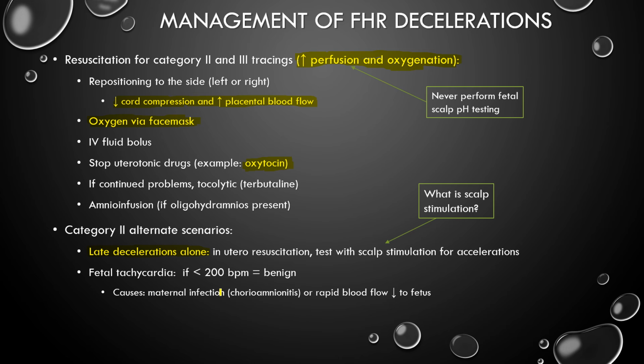So causing a maternal infection like chorioamnionitis or rapidly decreased blood flow to the fetus. So anything that causes decreased blood flow will cause the baroreceptor reflex to activate, and also maternal infection can cause it. And in these situations, if it's greater than 200, you will resuscitate as you saw above. And variable decelerations are usually benign unless they're recurrent. So you just have a couple of variable decelerations, you actually don't need to do anything. But if you have a lot of variable decelerations, you have to do the resuscitation that we talked about just now.